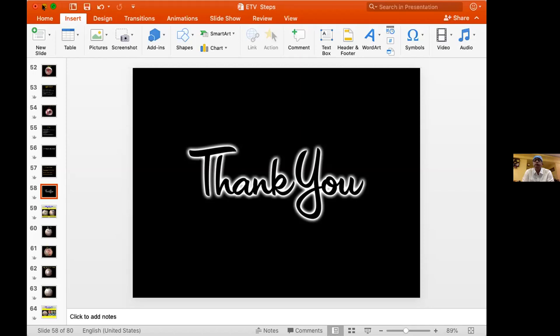Go on. Kaushik, excellent presentation. Congratulations. The only thing is whether you could have said a few words about what would happen if there is a bleed, especially for those who are just starting off. If they have a bleed, the main point is not to panic and pull out the scope. You have to keep irrigating till you find the bleed. It may take some time. You need to have patience and make sure that your irrigation is sufficient. And eventually, if it is a small bleeder, it will stop. So you have to be patient and keep irrigating till that is over.